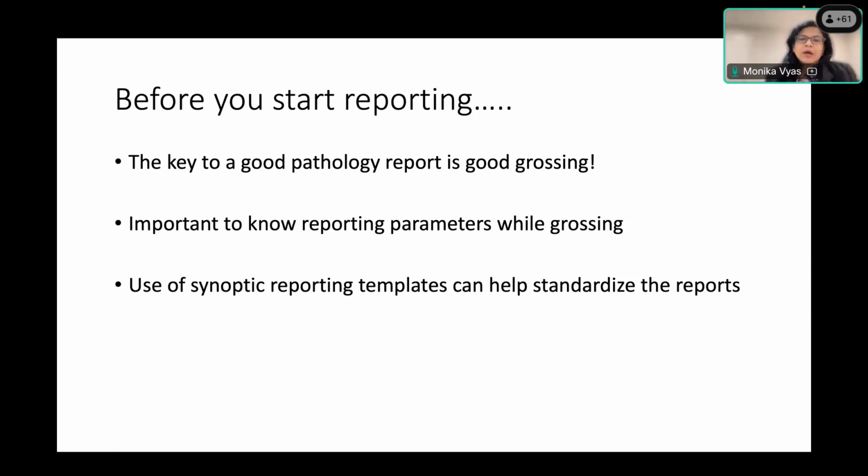So taking good gross images is also very important. And lastly, the number of prognostic factors and reporting parameters is increasing by the day. Every day we have new studies talking about this variable or that variable, which might have a potential impact on patient prognosis. So how do we remember to report all these parameters? Having a nice standardized synoptic reporting template can go a long way in standardizing these reports and making sure we don't miss any important reporting parameter.